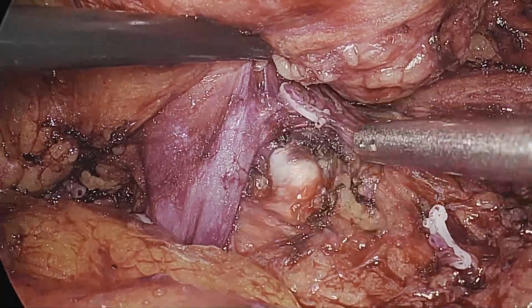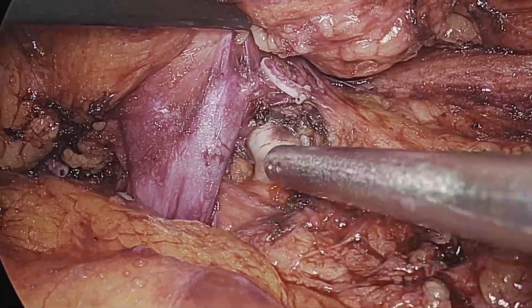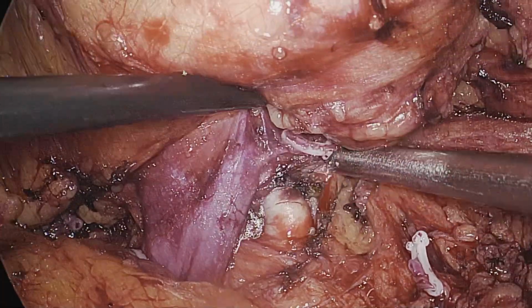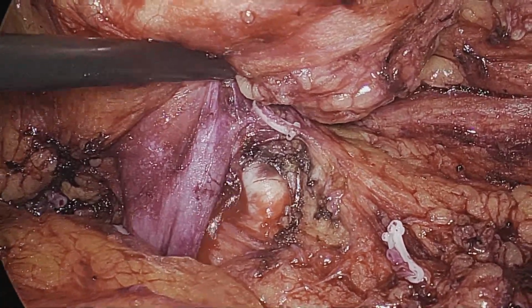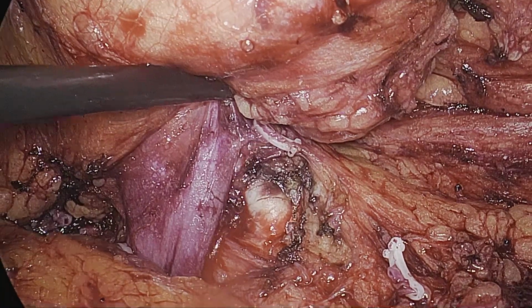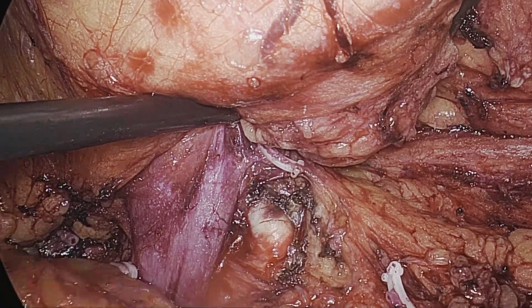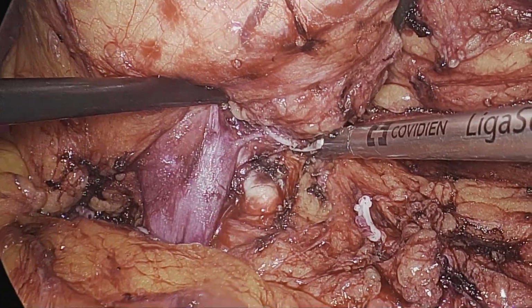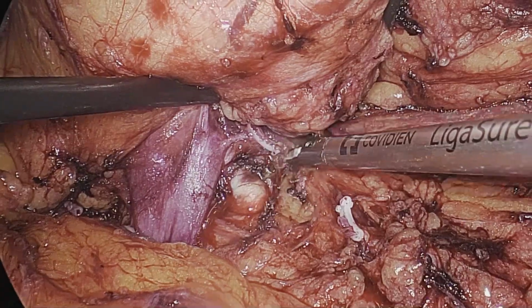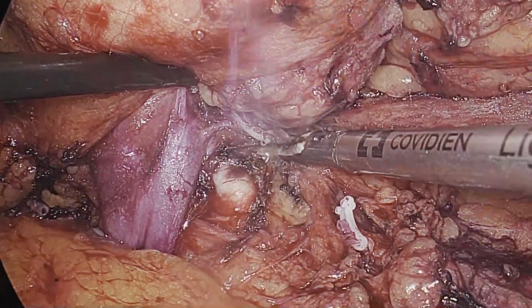So here the renal artery is dissected and it has come in view. The artery is appearing very high bulging, and we are suspecting some atherosclerotic changes and plaque in it. So we'll try to move around the artery to dissect it well. All the lymphatics should be cleared and sealed well to prevent the lymphorrhea later on.